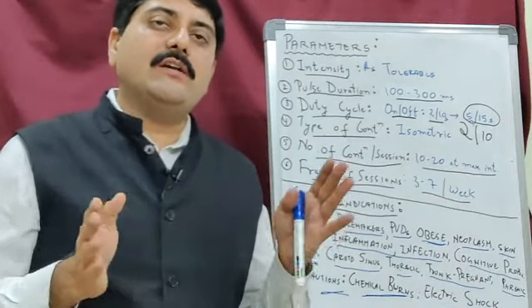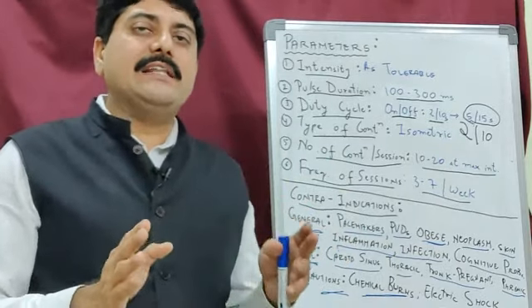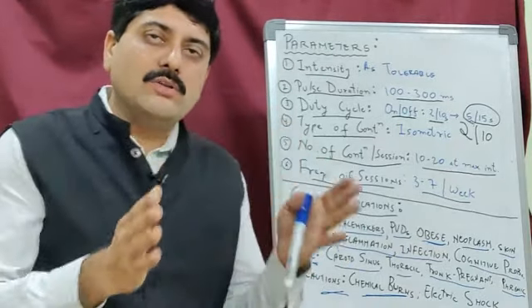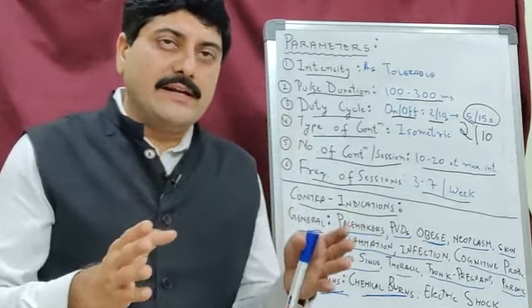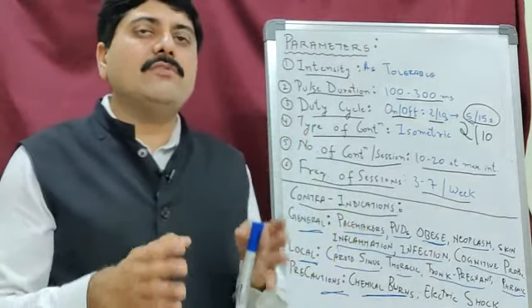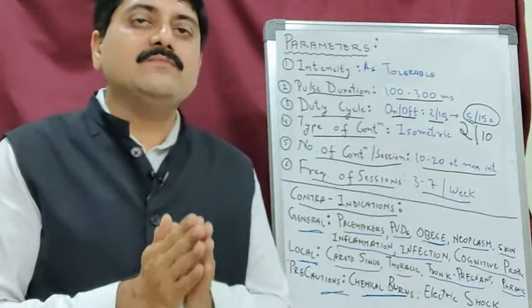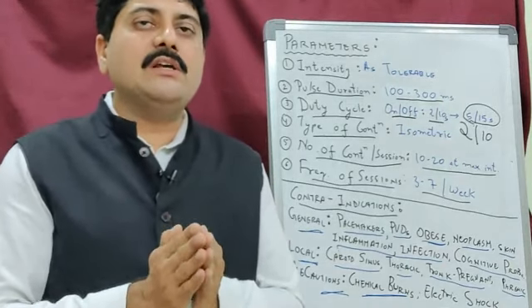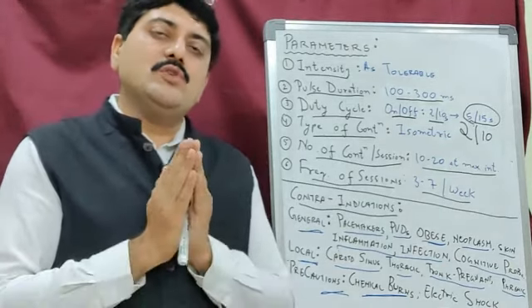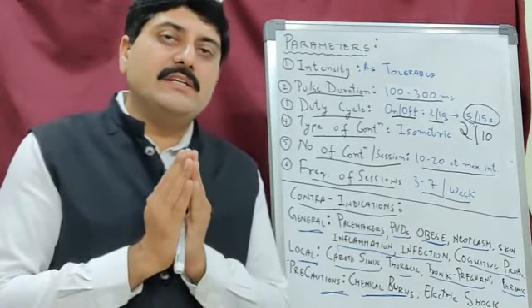If you are going to give long-term stimulation to the muscles, then you can go for 2 pad electrodes, placing them on both musculotendinous junctions of the muscle, and give a contraction to the whole muscle belly in cases of denervated muscles. But when you are going for motor point stimulation, that is the neuromuscular junction stimulation or functional electrical stimulation, you should not keep the intensity on, even if the patient is comfortable.